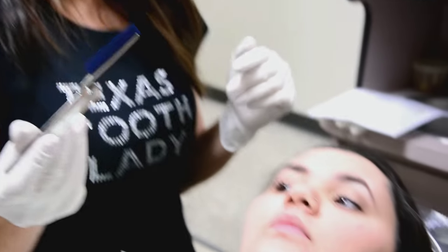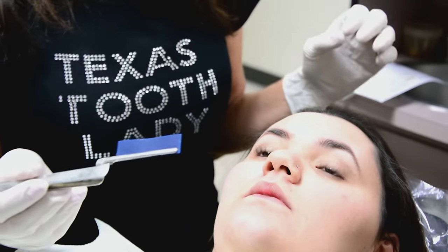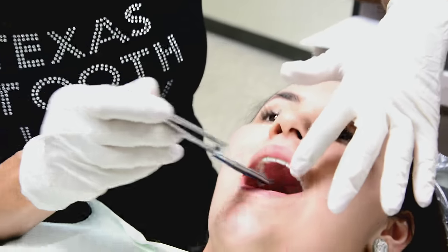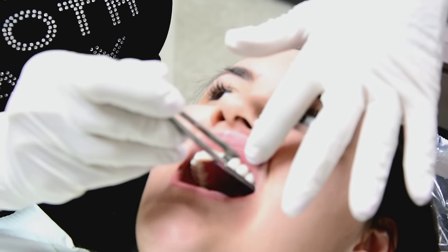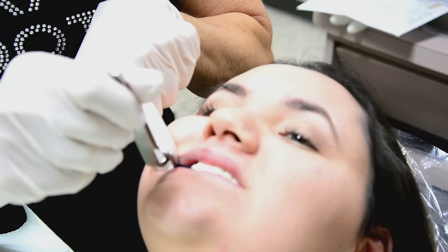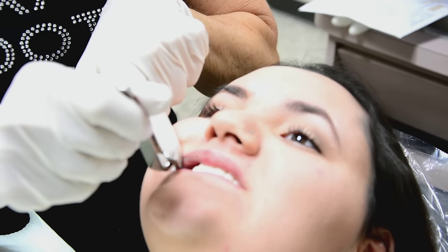The first step is to adjust the snap-on smile — it's very easy to adjust, just like a night guard. We go ahead and check her occlusion with articulating paper. We have her tap down hard a couple of times, then open, and we take a look at the marks.